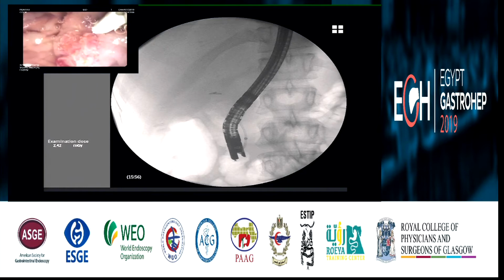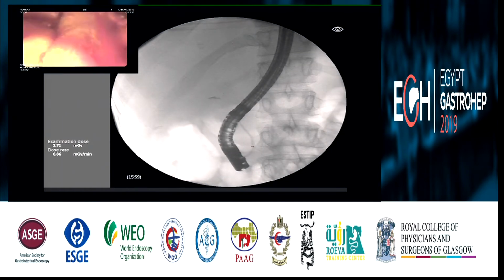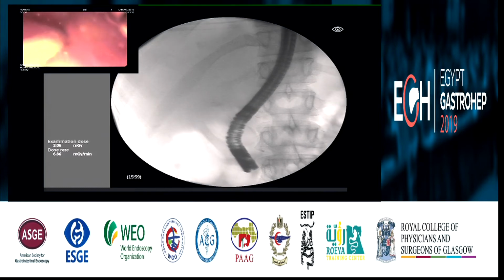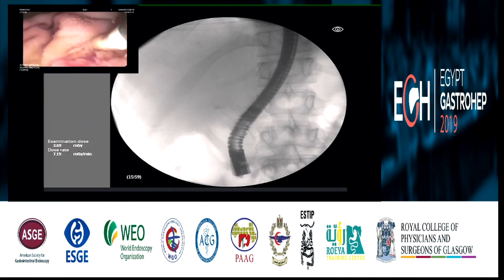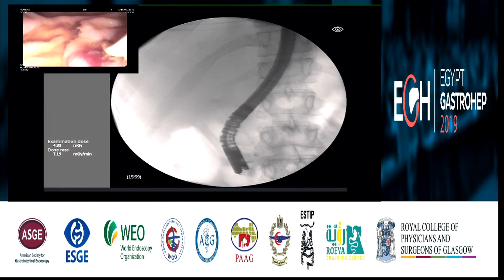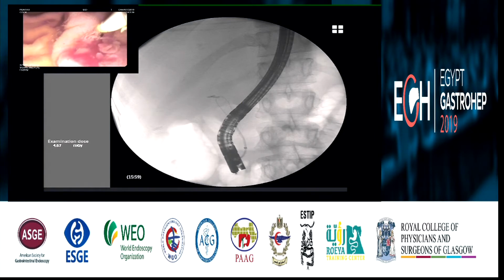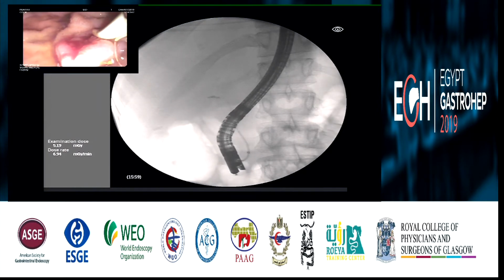Okay. You're trying. Okay, go in. Push the wire. Okay, go, go, go, deeply. It's looping backwards. It could be also the cystic stump. Okay, you can inject some contrast from here now. Or you can try, because look, you should do like this. Rotate. It's really floppy.